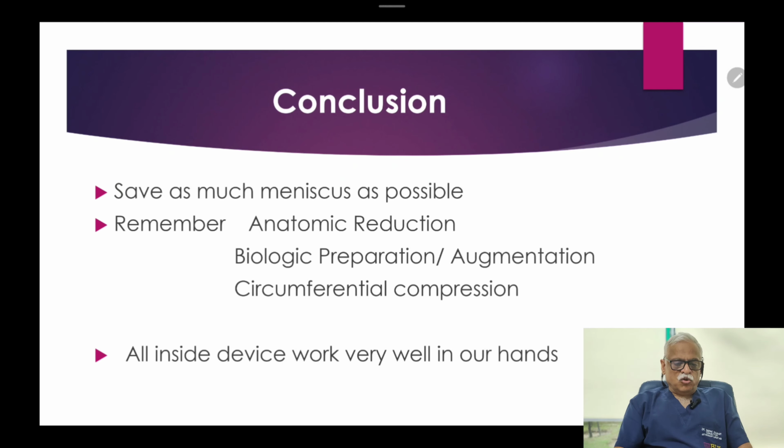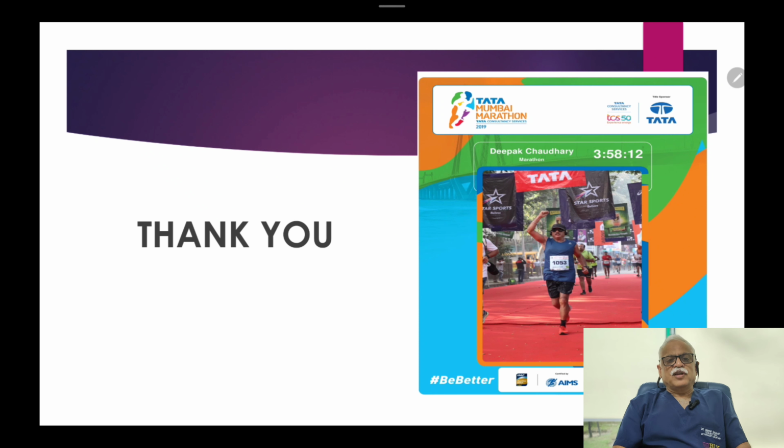So in conclusion, one must save as much meniscus as possible. Remember the ABCs of meniscal repair, that is, anatomical reduction, biological preparation, and circumferential compression, and all-inside devices work very well in our hands. Thank you very much for your kind attention.